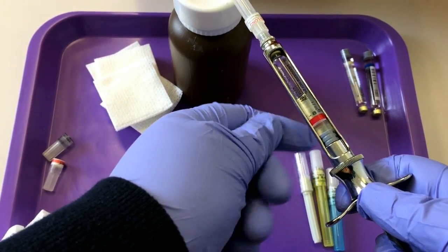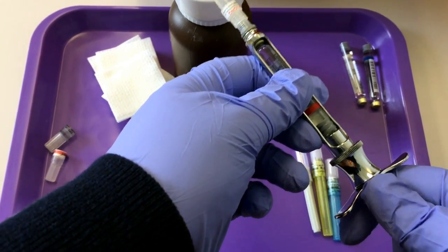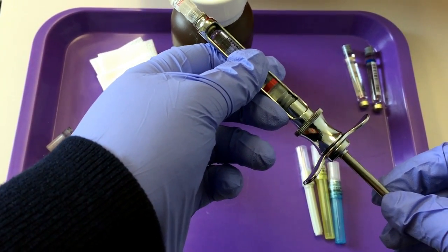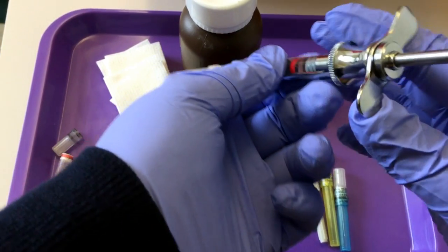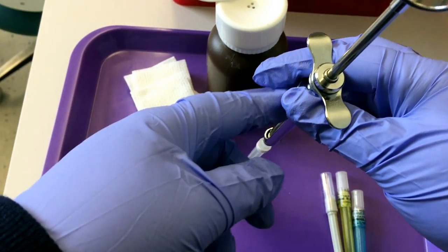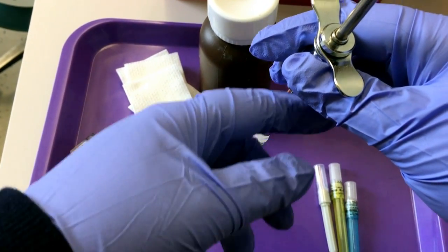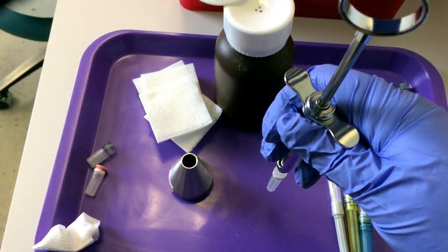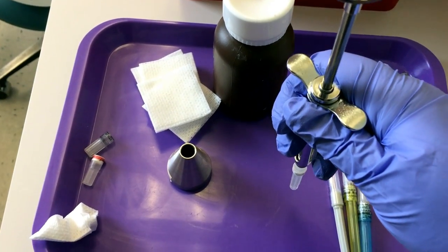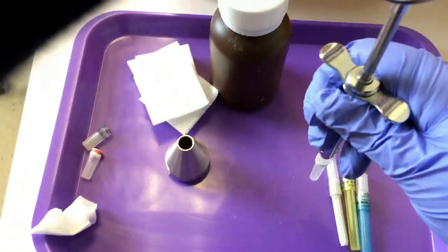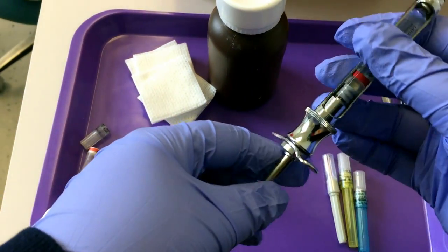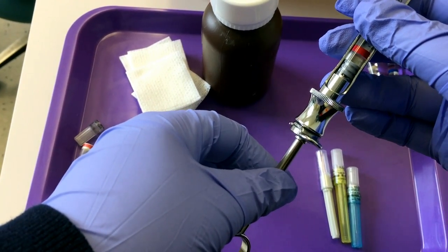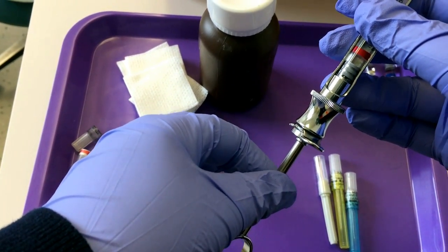Now we have to engage the harpoon. Right now it's loose. You can hear it wiggle around. To engage the harpoon, turn your assembly so that it is needle down and give it two quick smacks on the thumb ring. You can then try to wiggle your piston, and you hear that it is not moving.